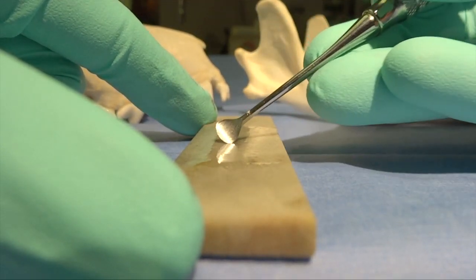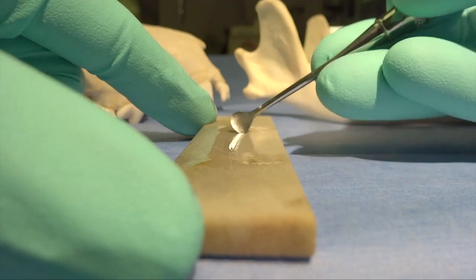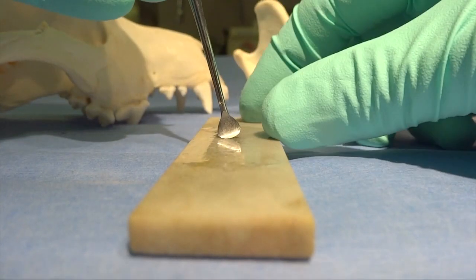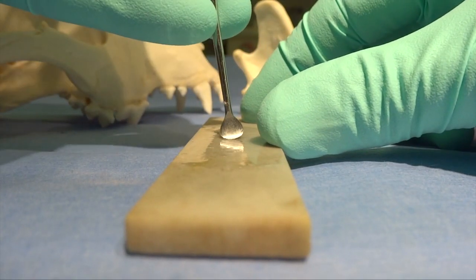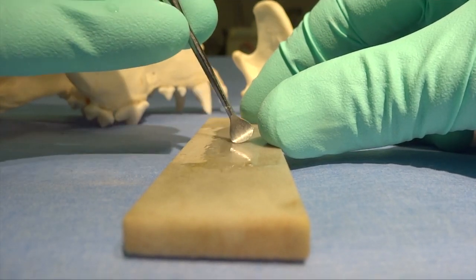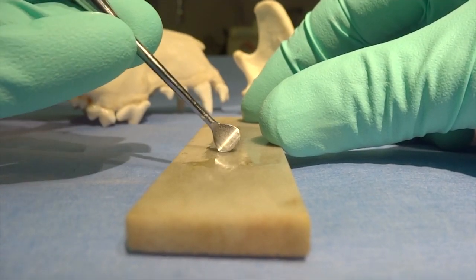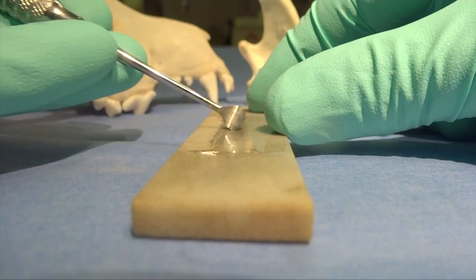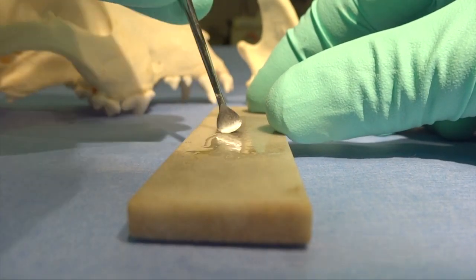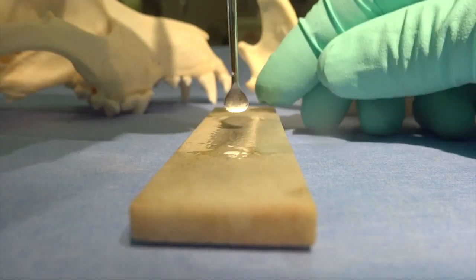For a periosteal elevator and for a luxator, that places that instrument perpendicular to the stone itself. You can see I'm utilizing up to and about halfway on the lateral aspects of that periosteal elevator.